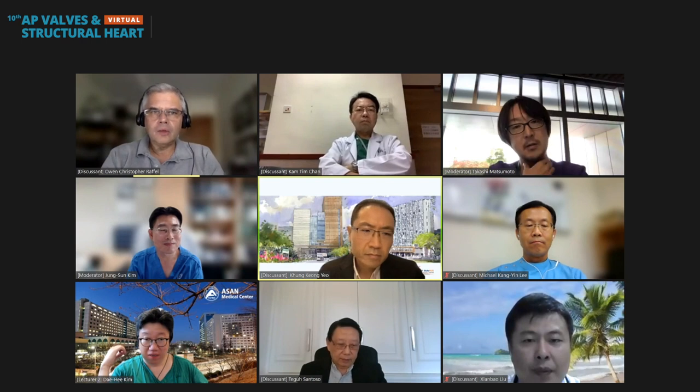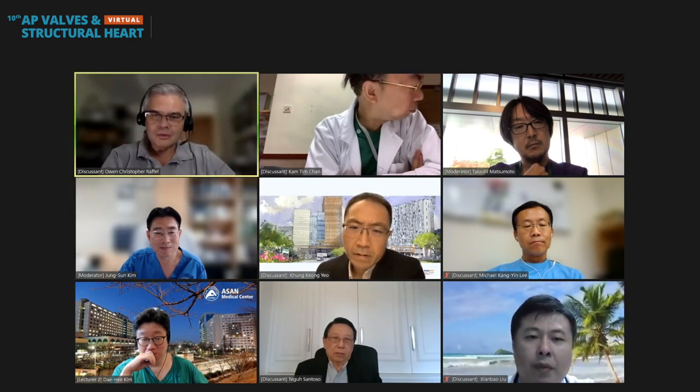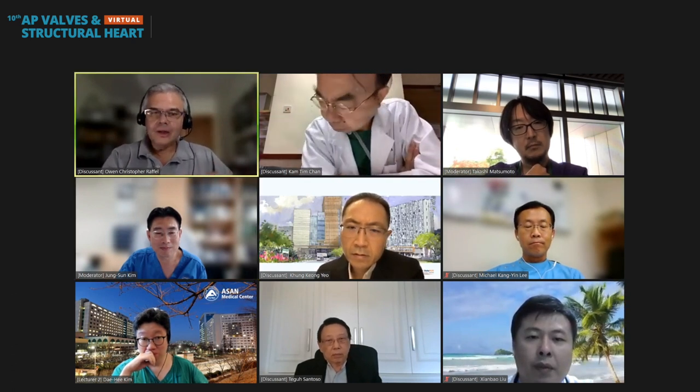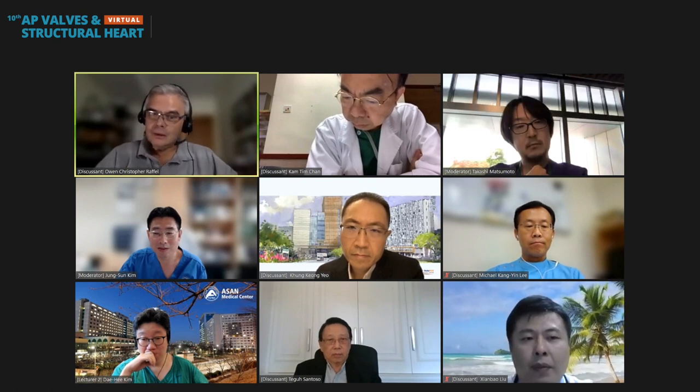Yeah, and the other thing there, we do see a small group of patients who have very stiff atria, where the pressure gradient tends to go quite high with even one single clip. But we've been routinely doing very careful 3D measurements of the orifice created post-clip, and sometimes that orifice is actually quite large. It's just that these patients tend to always have high pressures in the left atrium, and that creates a high gradient. So at some stage, with gradients of 7, occasionally 8, the mitral valve area after the clip is actually quite big, and fingers crossed, we released the clip and they've still done well.